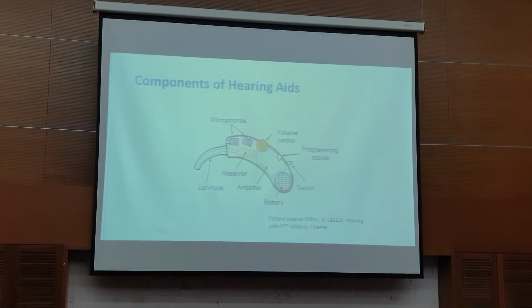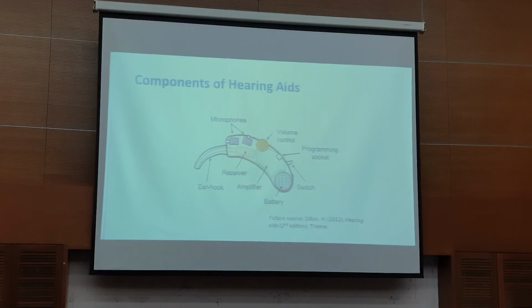So you lose the resolution. Jadi you dengar orang cakap, dengar tapi tak boleh nak faham butir-butirnya tu, susah. And it's distorted. Alright? And that cannot be helped with hearing aids. Cannot. Even cochlear implant pun tidak. So it helps to amplify the sounds, but it doesn't help to make them sharp and clear.